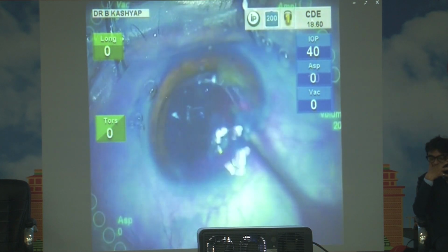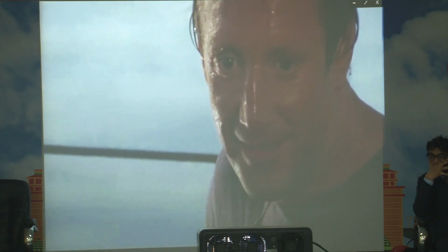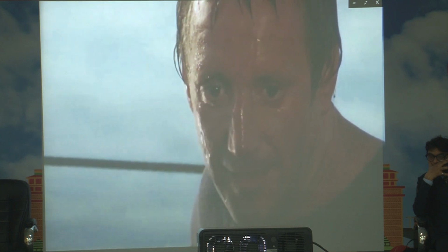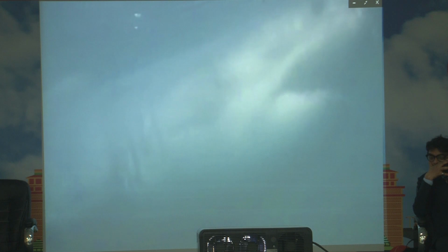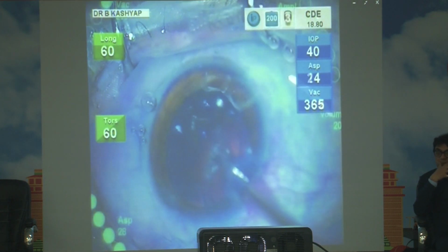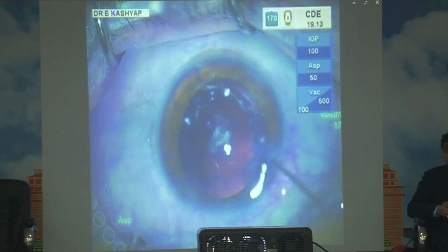But oh my god, what am I seeing? I thought the surgery was now getting over and I was done. But I can still see the white shark deep within. There is a thick posterior capsular plaque centrally and a thickened central posterior capsule as well.